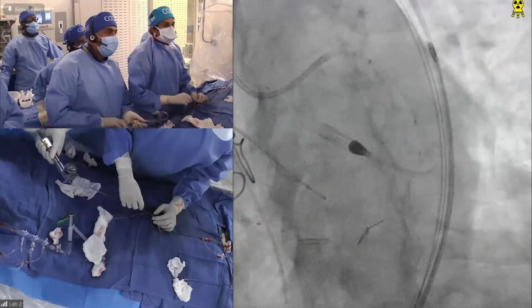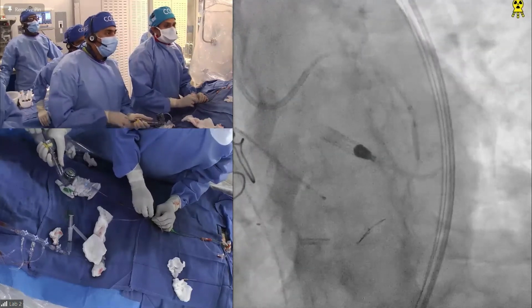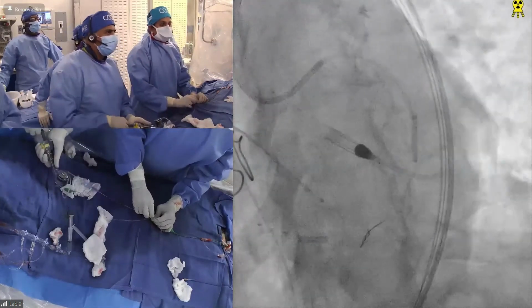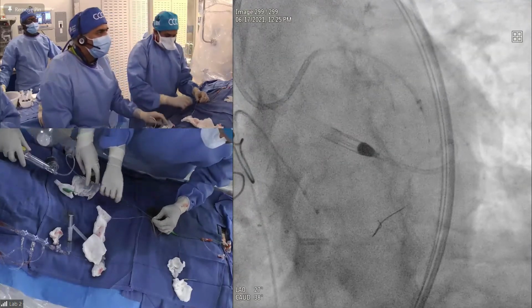Yeah, I saw that. We'll go now. Come back a little bit. So advance, yeah. That's it, now deeper. Let's do that spot there. You want to do that spot? Yeah. No, we did it. I have to come back a little bit with the balloon. Get the mouth.